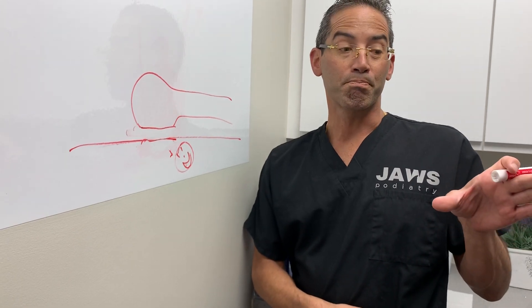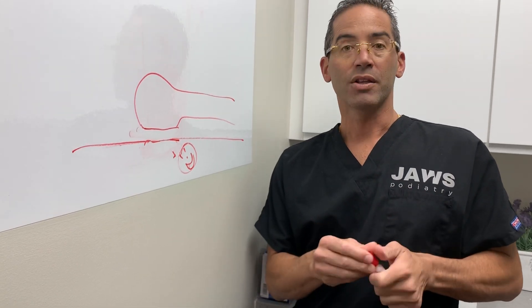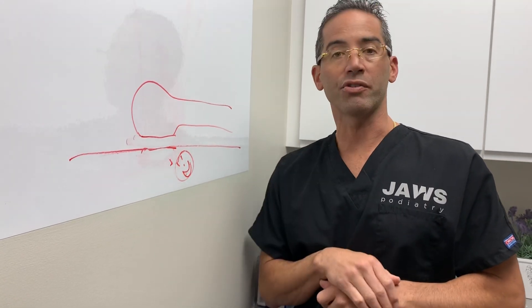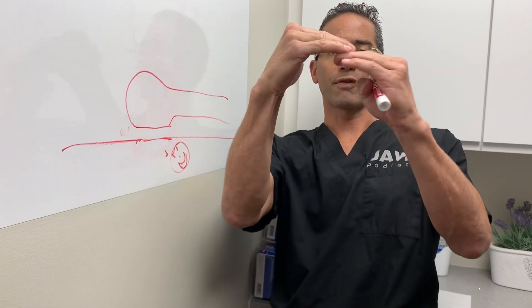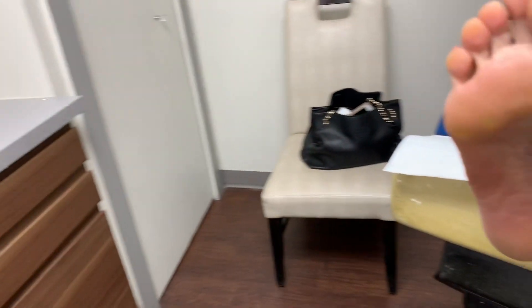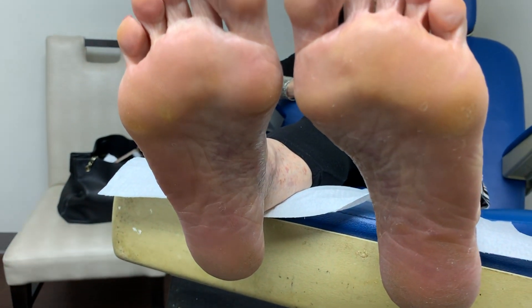She's basically the perfect candidate for a lot of reasons. With time, the very little amount of fat she has will continue to disappear. Her foot structure — she's got a high arch foot, so basically all the weight is on the front and on the back. But right now, we're going to enucleate and extract that corn underneath the fourth metatarsal head of the right foot.